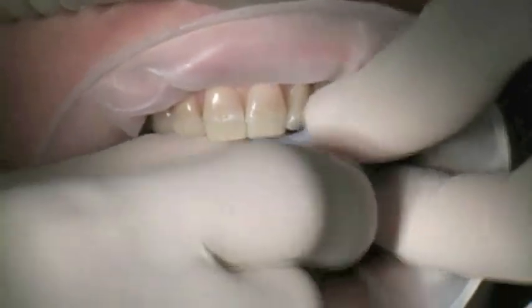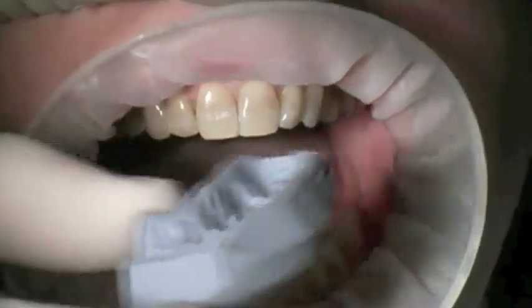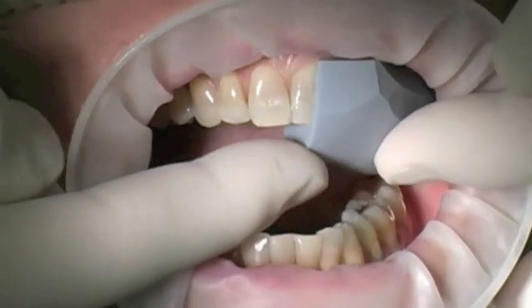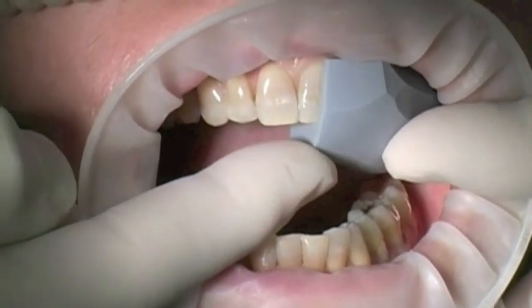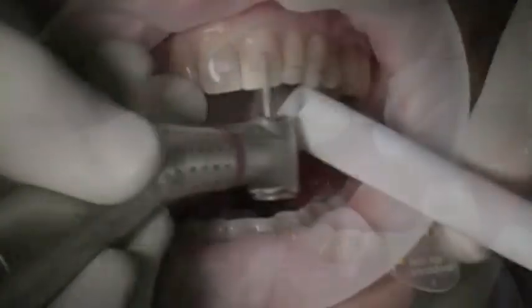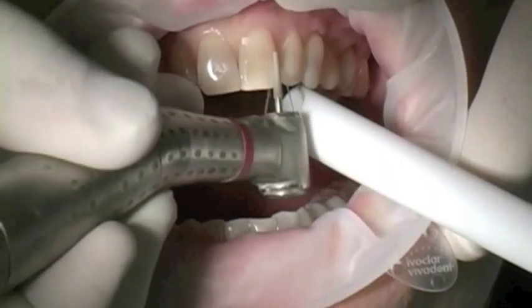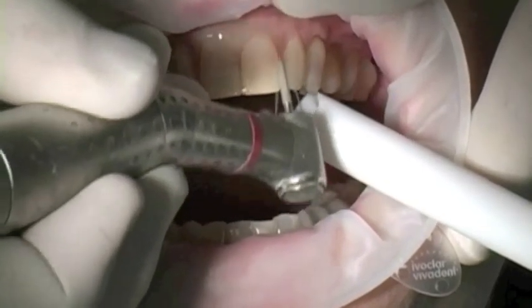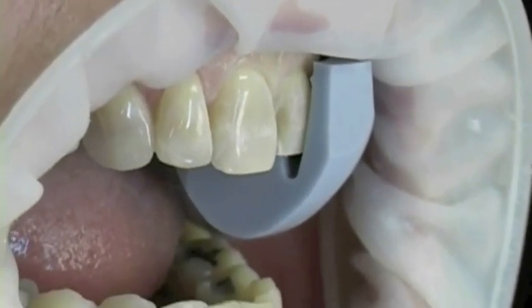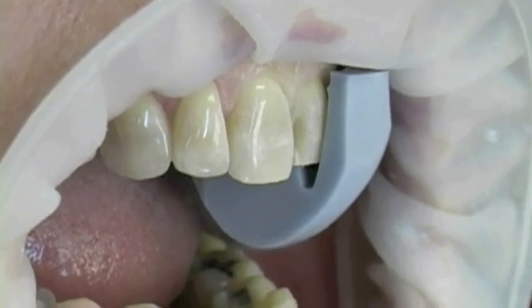I will cut that in just a second. Open up for me real big. You can see the index, when it's actually placed in the mouth, does actually fit. And just what I would consider beginning reduction — and as you can tell, we obviously do not have one millimeter worth of reduction on here.